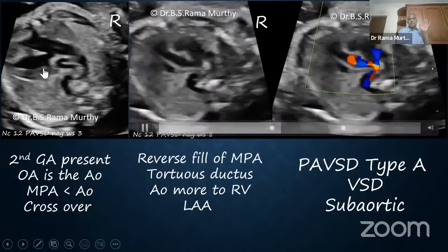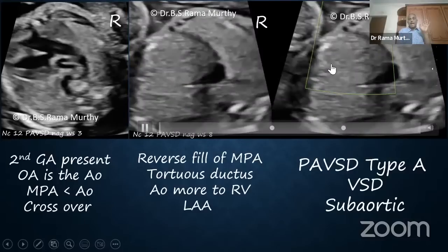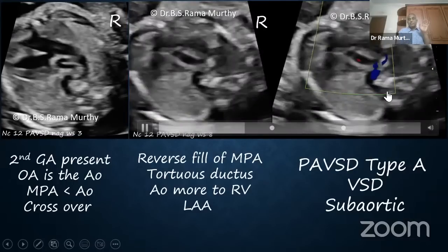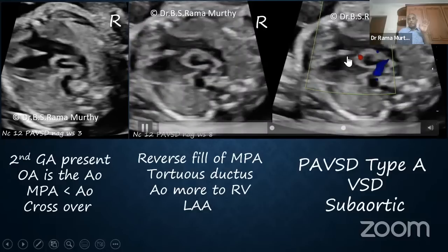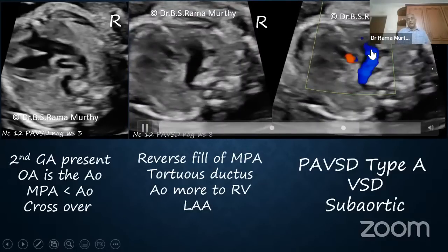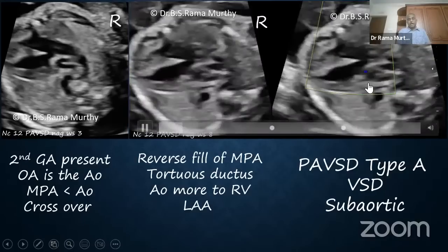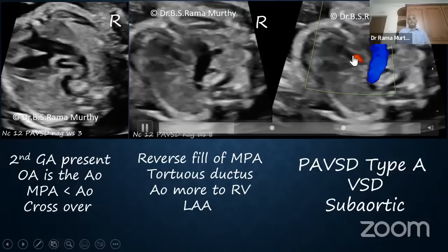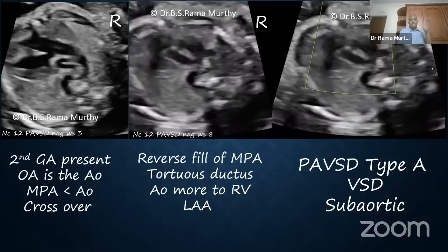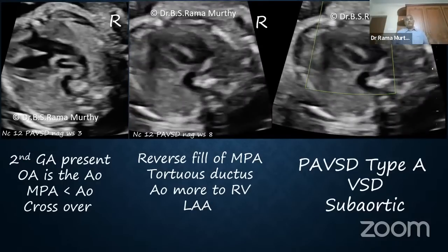A pulmonary atresia. Why? Because only if the pulmonary artery valve is atretic, you will not have blood getting pumped antegrade. The blood will be fed to the pulmonary artery thanks to the patent ductus and thanks to the blood flow from the huge aortic arch, which is now going to go through the ductus and reverse perfuse. So this is a PAVSD, and here we realized, we identified the great arteries correctly.